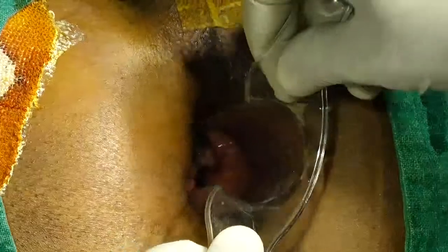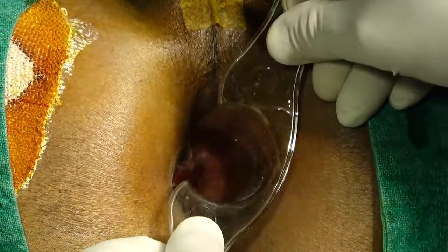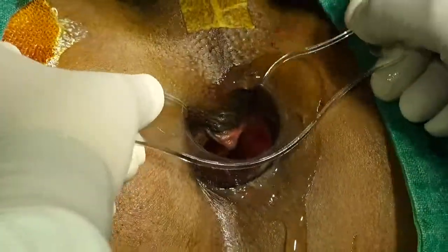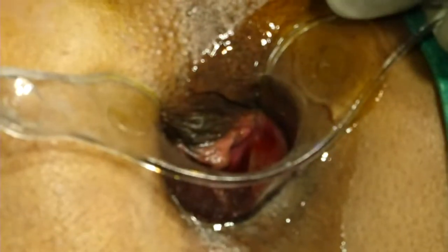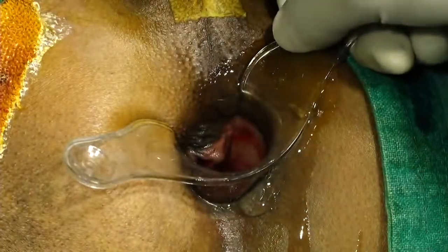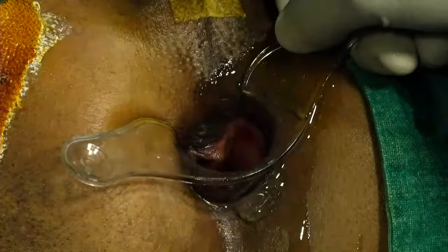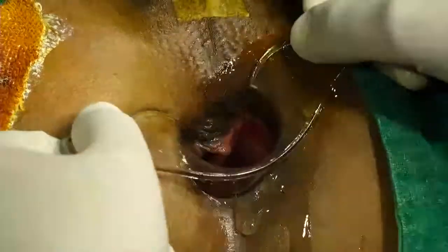Another question is about tying. So again, I am not touching this proctoscope because it may be easier. HAL before the laser or HAL after the laser, there are two schools of thought. I am trained by Dr. Kalyankar, and he has given a statement regarding that: please do laser first, because your laser will cut your HAL suture. This is the idea regarding HAL and laser.